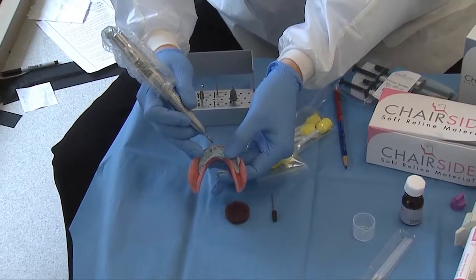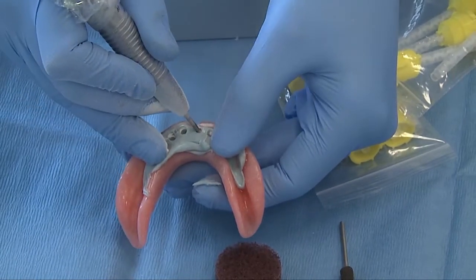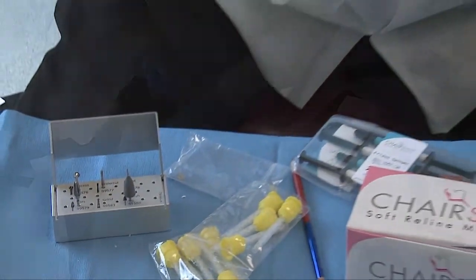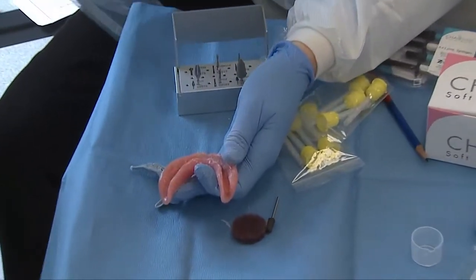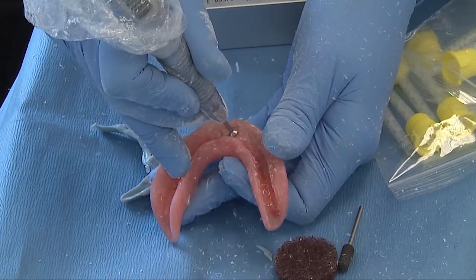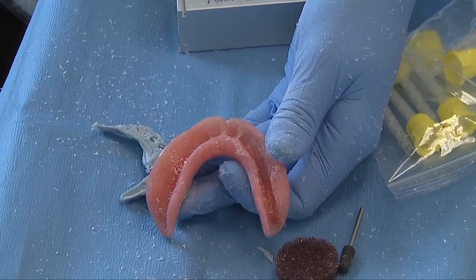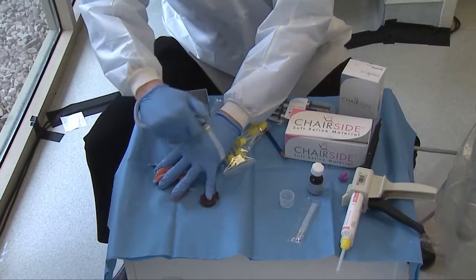Now I'm going to take my grind burr, activate it on medium speed, and just make a mark right inside of there. That gets you started. Pulling this apart, I now have a couple of little dimple holes inside of the denture. At this point, I'm going to take my locator recess burr and create a hole that's a little bit larger in those areas. The locator recess burr has made short work of it, providing recess holes that are appropriate — and that's all I'm going to do today, because it gets us close to what we need for the chair-side soft reline.